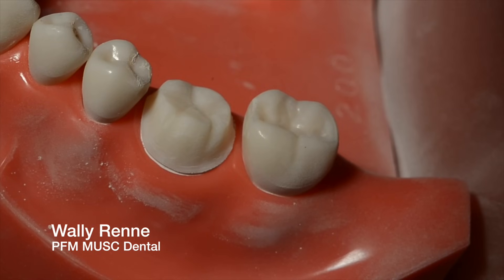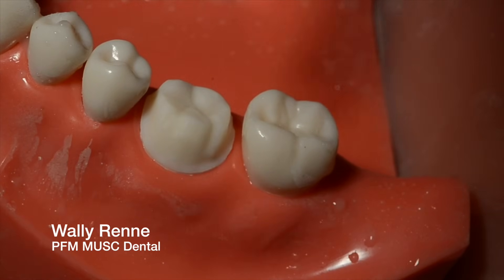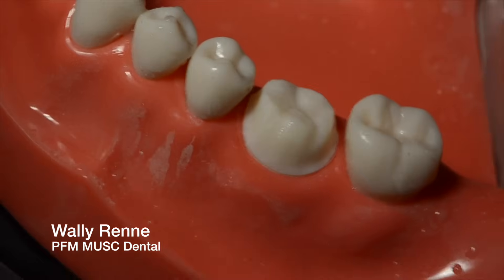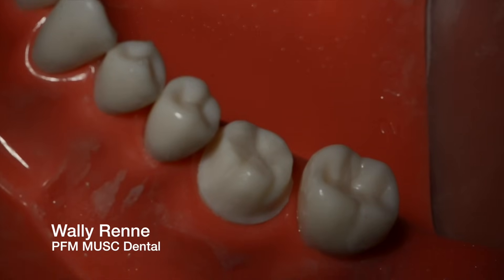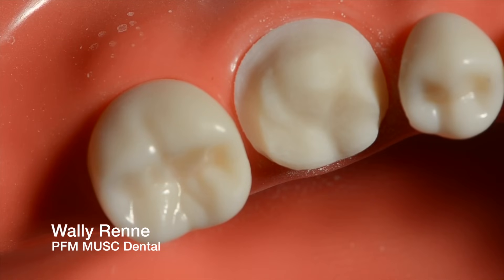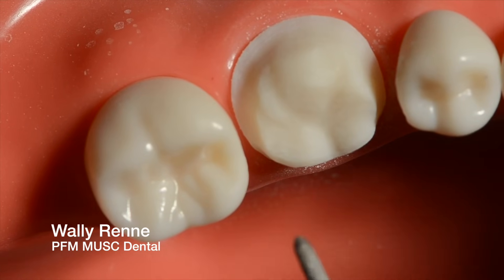It'll give you like a 75. What you need to do is learn how to take something like this — which is like a five-minute prep — and turn it into something that's a little bit more amazing. Spend some time smoothing things and looking at your prep, determining what you could do to better it. Because it's not about just doing a clinically acceptable prep — it's about doing, for the patient, the best work that can be done. If you went in for heart surgery, do you want just an acceptable heart surgery, or do you want one that's going to be really good? So now we're going to just smooth some things. Notice the heavy chamfer there, and then as you start to go to the lingual, you start to get a lot lighter.